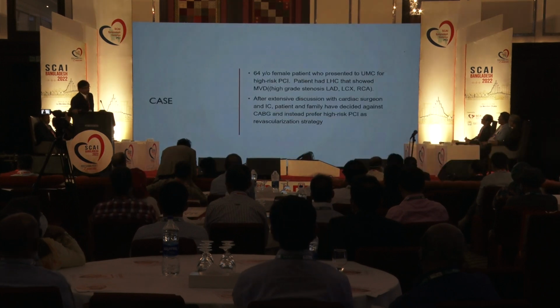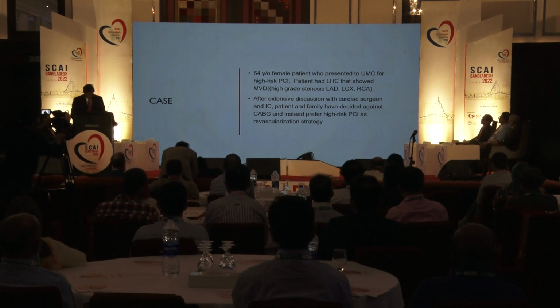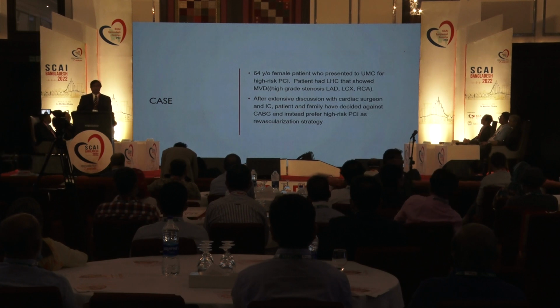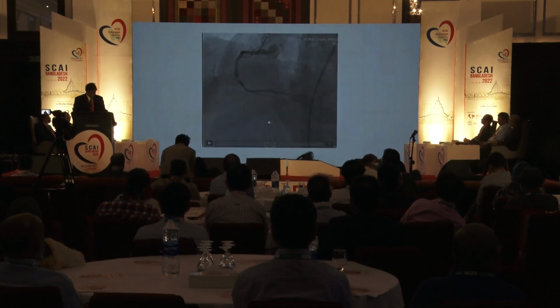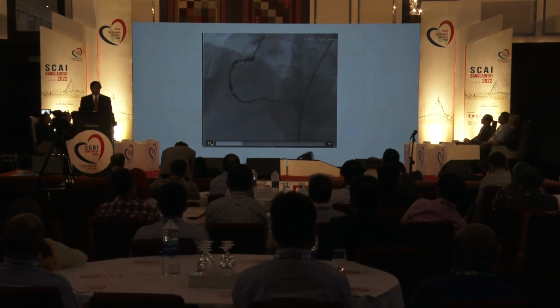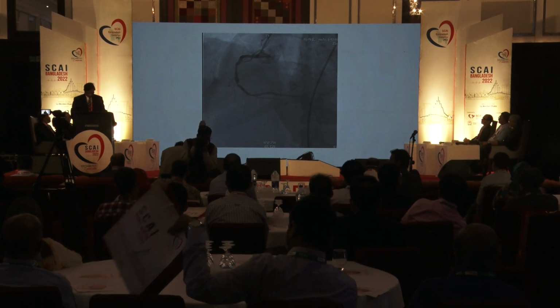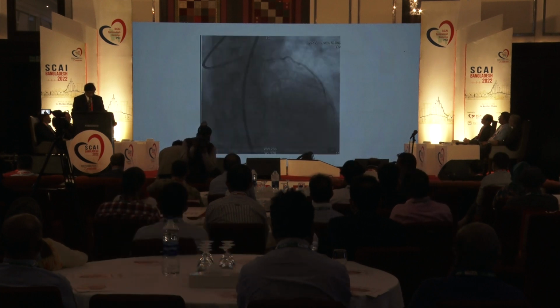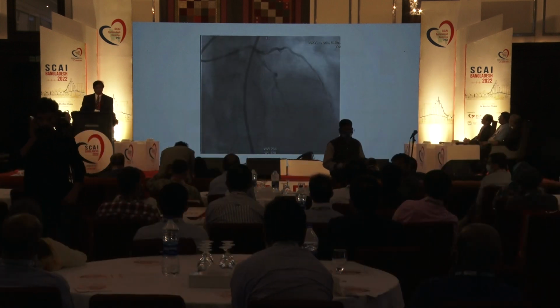So this is our patient who presented with multivessel coronary disease, referred from, actually we are getting these patients now with CTA first, high calcium score, go for a CAG, and this was done in an ambulatory care center, and this was the right coronary artery, and then this is the LAD.